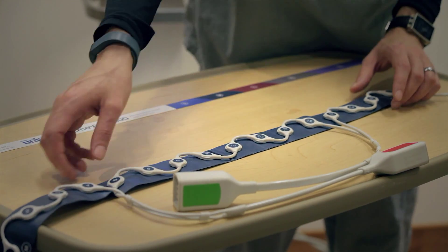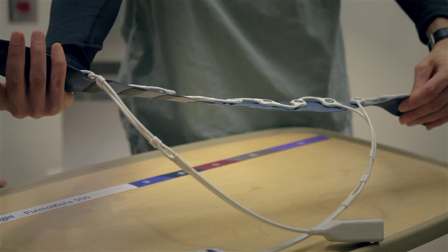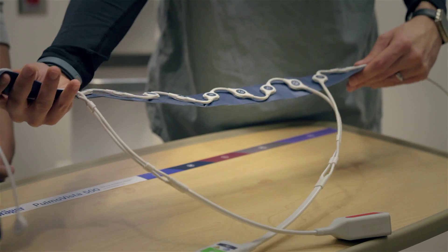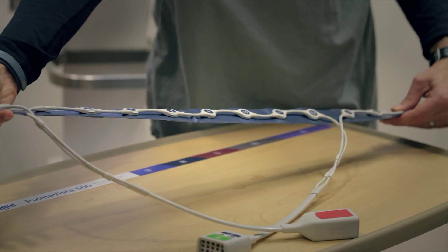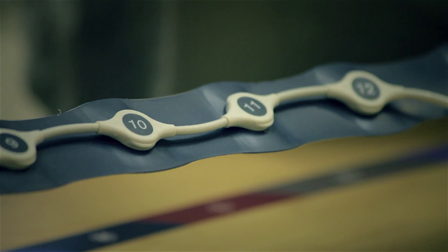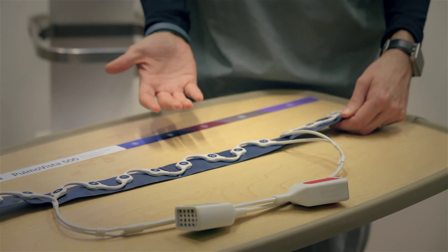The reason it's in a zigzag pattern is because when you have it on a patient's chest, as they breathe, their chest will expand — watch what happens to the leads. It allows for that expansion. If you just connect these in a straight line, it wouldn't be able to move.